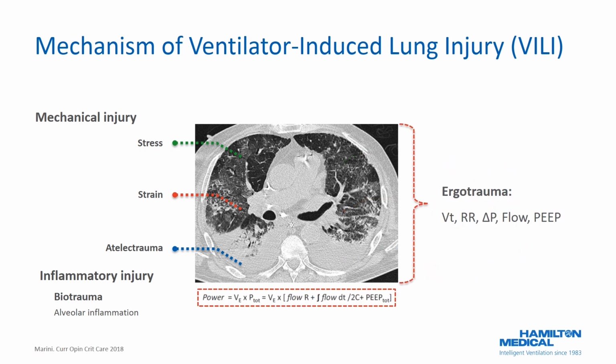The mechanical stimulus of ventilator-induced lung injury involves breathing frequency and dynamic features of the tidal cycle, as well as the static elements of inflation such as plateau pressure, PEEP, and driving pressure. The energy load imposed by repeated tidal inflation, otherwise known as power, plays a central role in the injury process.